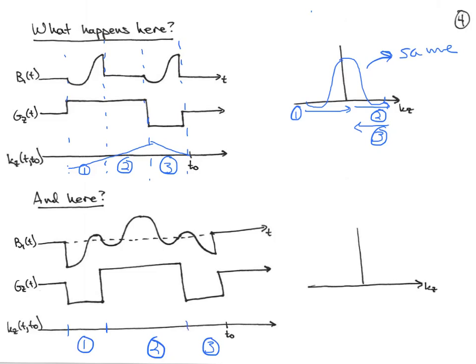And we already saw the gradient waveform for this, right? It looks like this. You're just going to go down here and go positive, and then go back down to 0 in time segment 3. Okay. So then what do we have? During time segment 1, we're going to start out at 0 and go negative, right? So we can draw that on here. We're going to get to a negative KZ max there. And what are we playing? We are playing this negative pulse here, right? So it's going to start out like this, right? That's the K-space energy deposition.